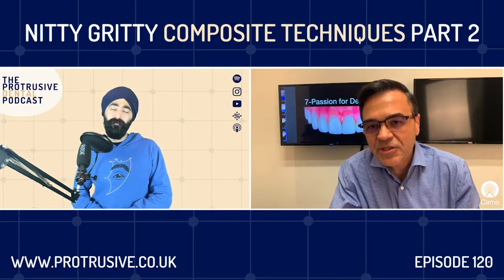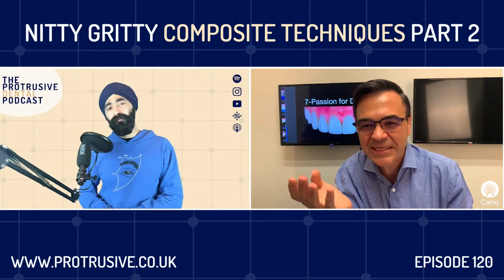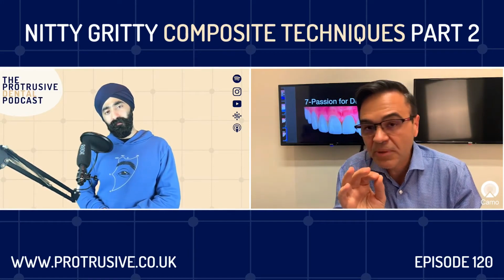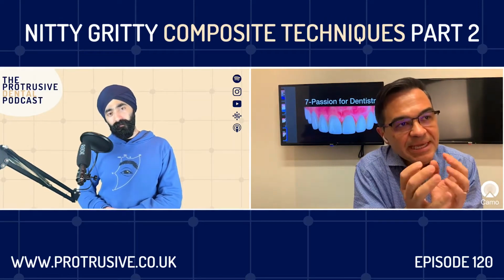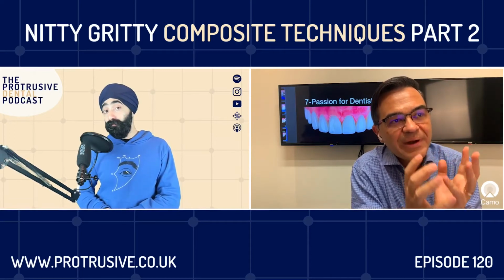Sometimes on your porcelain veneers, you get that grainy looking veneer that tells you immediately that it's porcelain, that it's not enamel. And you can control that by polishing your composite veneers to make it look like enamel, which sometimes if your lab technician didn't do a very good job, then the texture of the ceramic will look artificial, will look grainy.